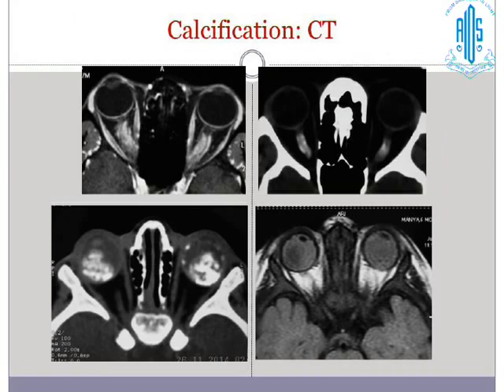This is one example in which a middle-aged woman was having a perioptic enhancement on MR, which could be anything actually. Although now, since you have a differential: a perioptic neuritis, sarcoid, or even meningioma. So the CT images do show what looks like a tram track, diagnostic of a meningioma in an appropriate clinical setting.